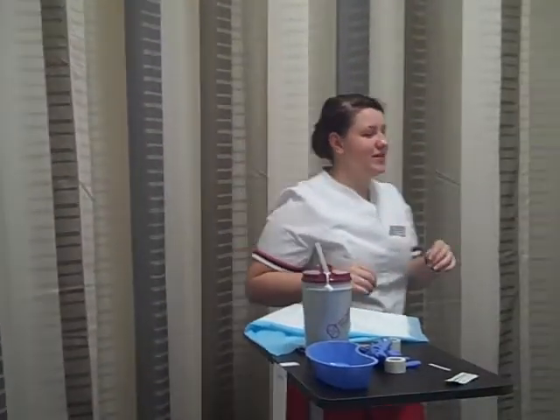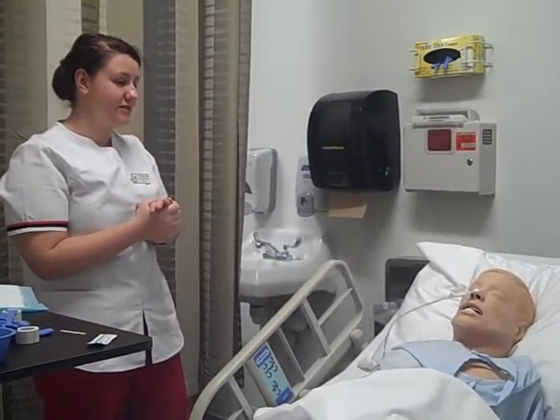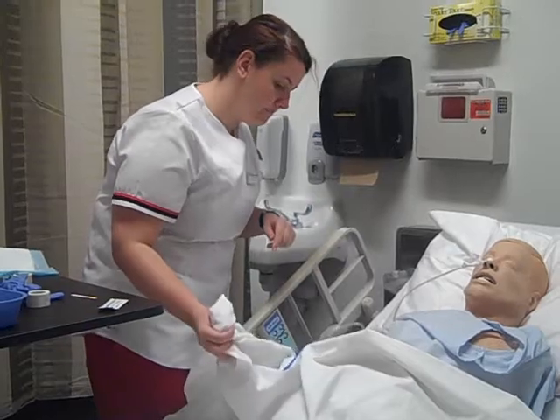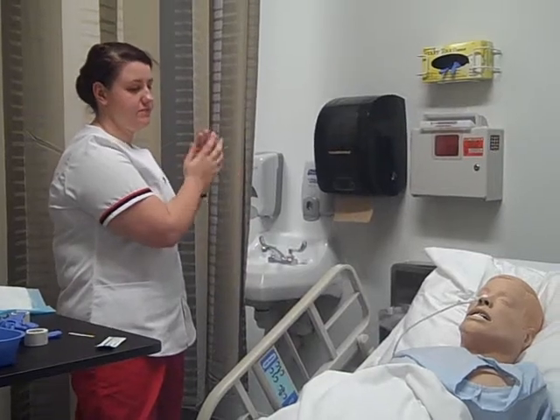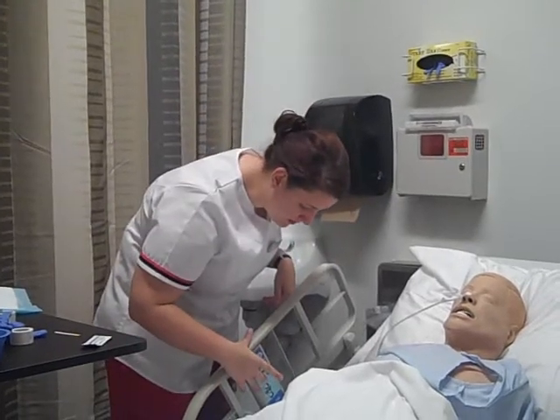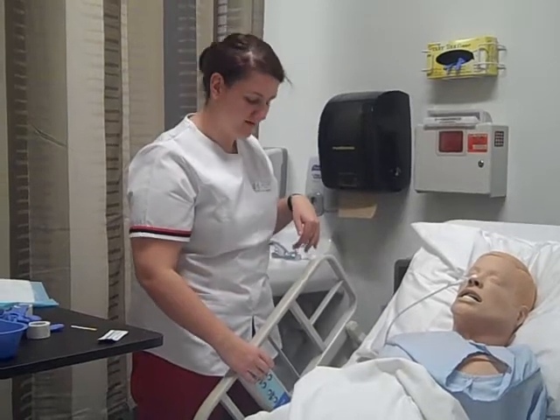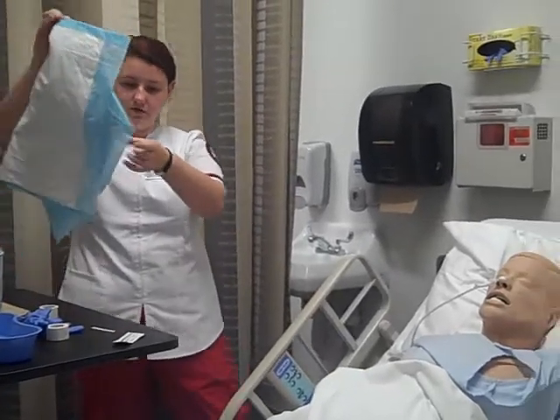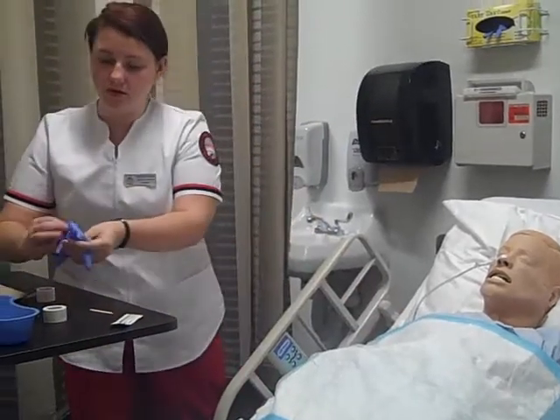Hi, Miss Amy. My name is Shelby, and I will be your student nurse today, and I am here to remove your NG tube. Before we get started, can you tell me your name and your date of birth for me? Thank you. Okay, and I'm going to perform hand hygiene. And now I'm going to raise the head of the bed up for you. There we go. And I'm going to put the linen on you, and put on my gloves.